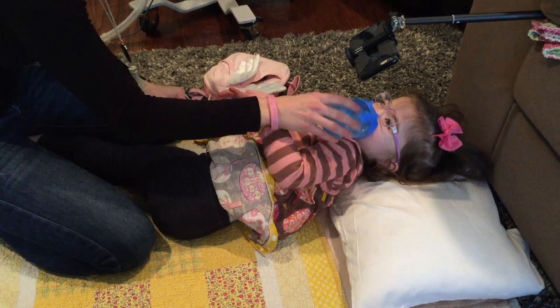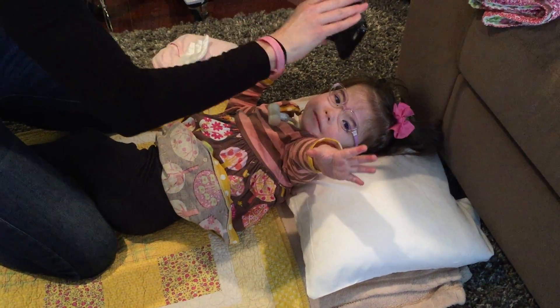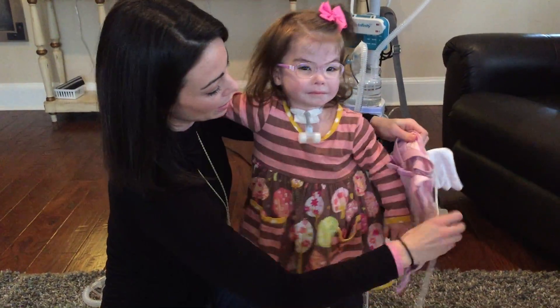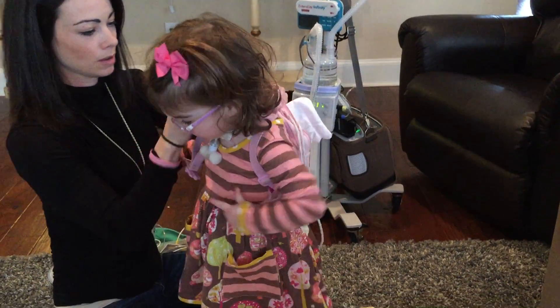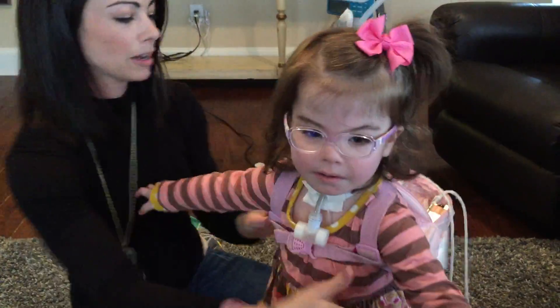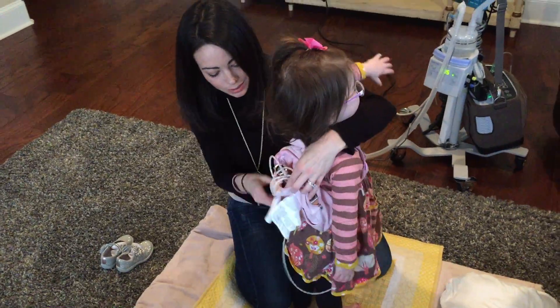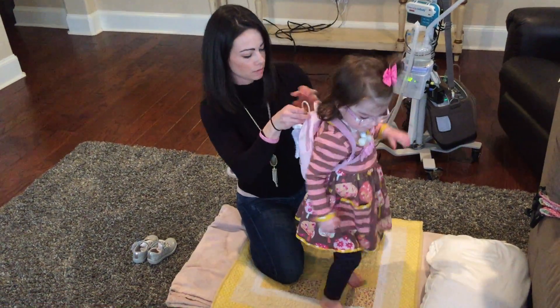Here's sister — say bye-bye phone. Okay, here's daddy — let's stand up and put on your backpack. Let's put it on your backpack. I zip you up first — snap, snap. Let's turn around and put in your cords. You can see the cords are a little too long, but we just wrap them up a little bit and zip them into the backpack so everything's contained in here.